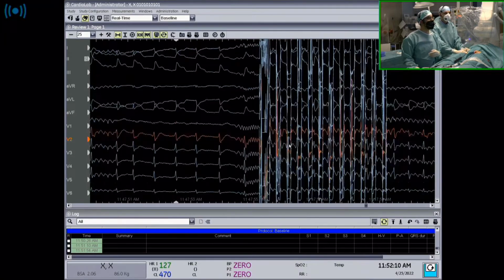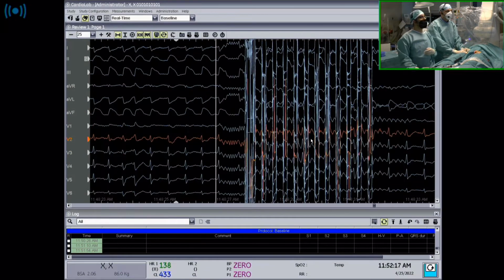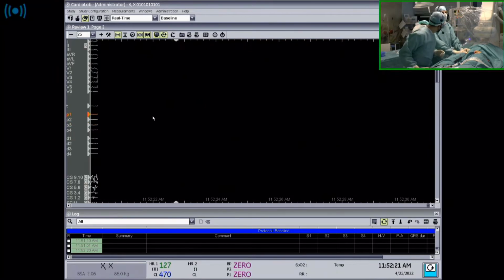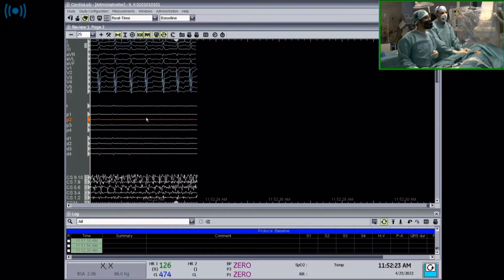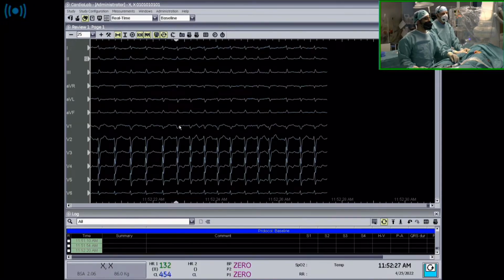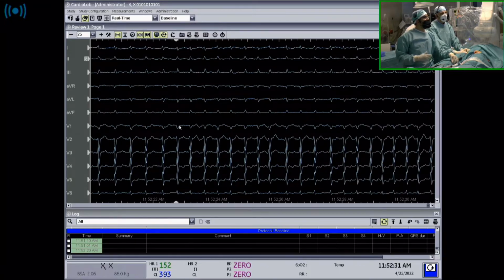So this is the start, and it was unexpected. Can you update now, Wojtek? Let's see what happens. Now it's good. Now it's back to normal. You see the ECG is normal. We gave some drugs because we had a hypotension, so if this changes on the ECG, now it's a little bit faster response. I must say I'm very surprised because I haven't seen something like this before. No, we haven't.